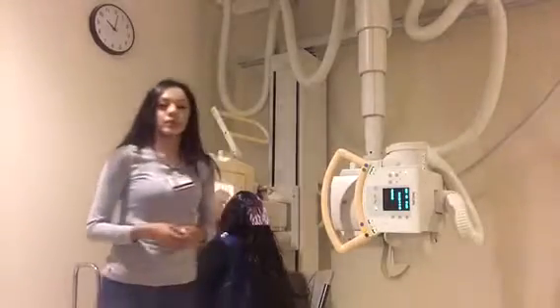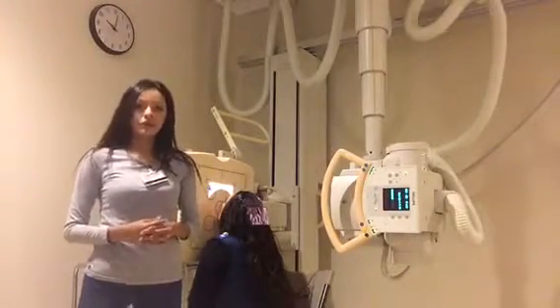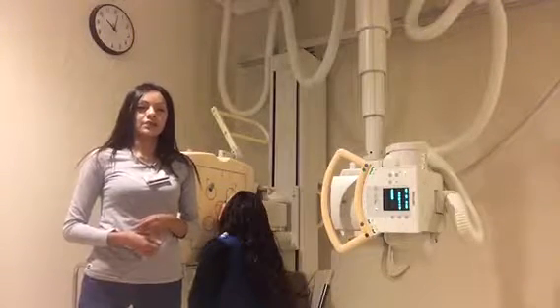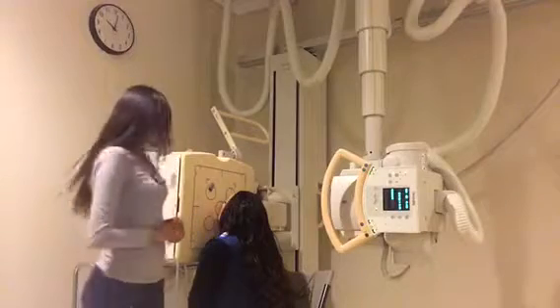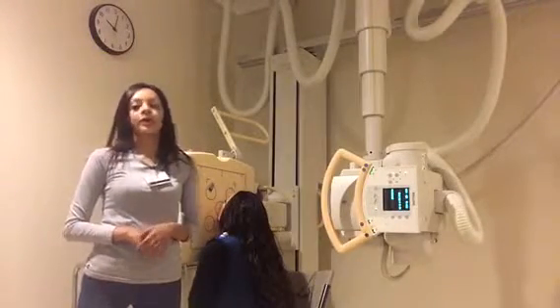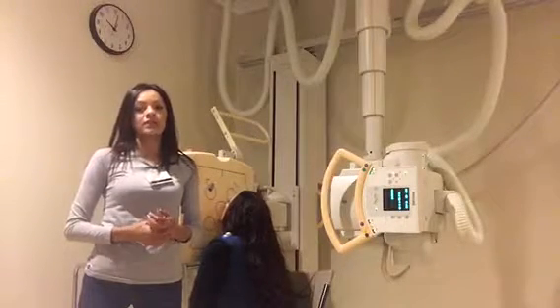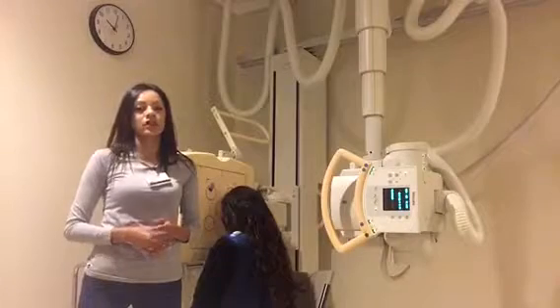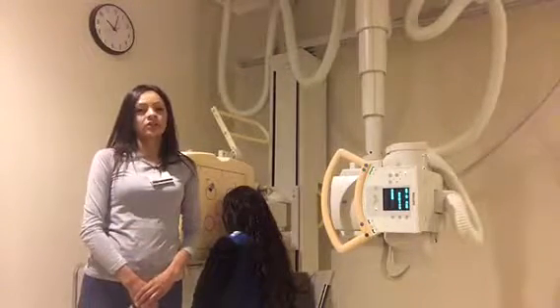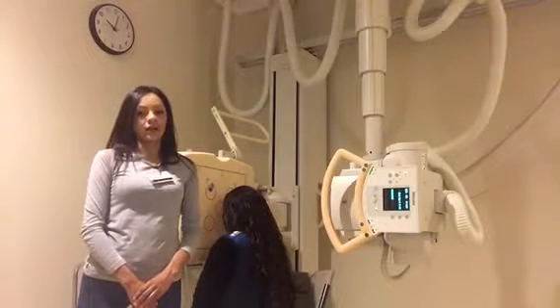So the next projection that I'm going to be doing is the submental vertex, ethmoid and sphenoid sinus. My central ray is going to be horizontal and perpendicular to the IOML, and the central ray is going to be 3/4 inch anterior to the EAM. My mid-sagittal plane is going to be perpendicular to the IR, and my IOML is going to be parallel to the IR.